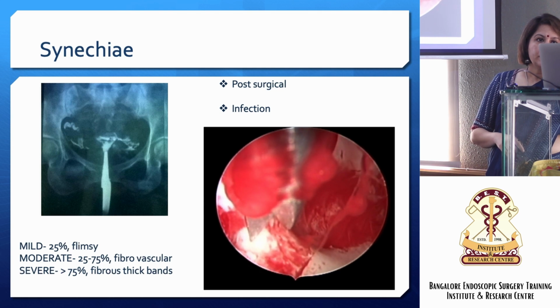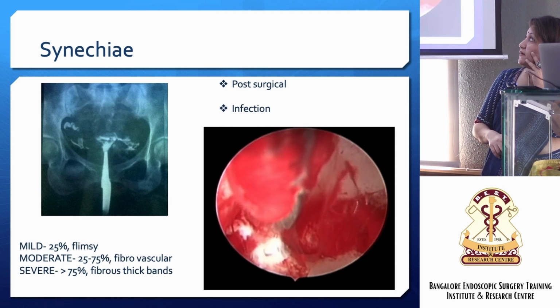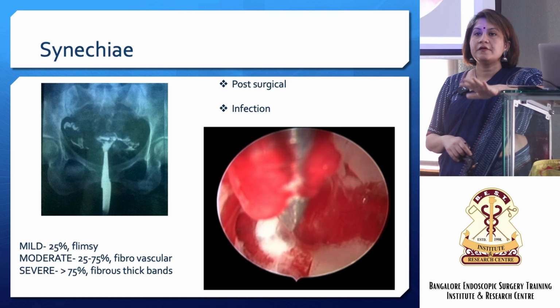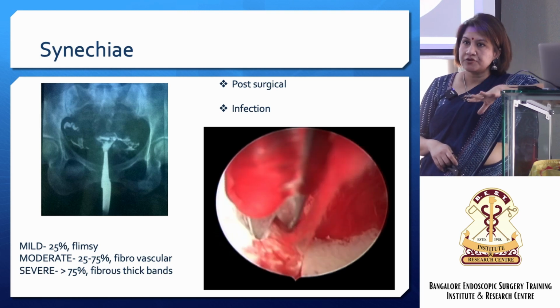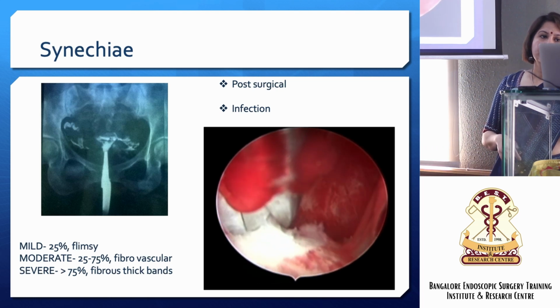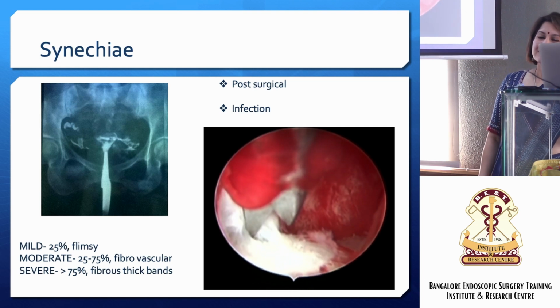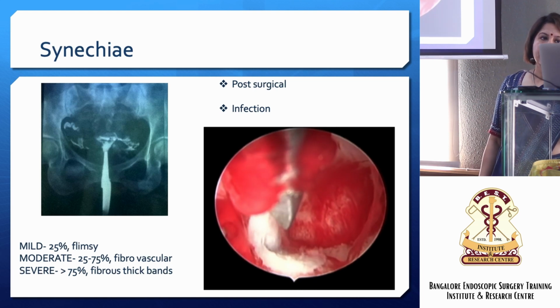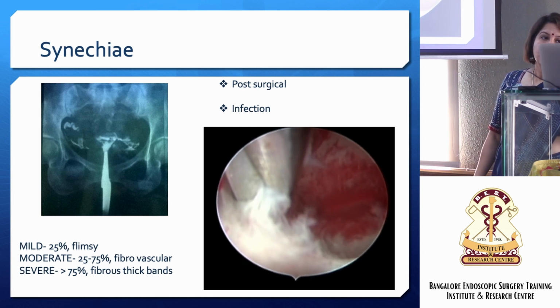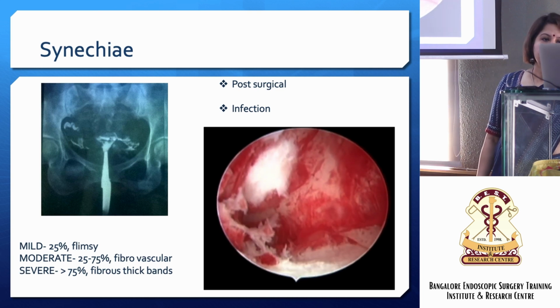The other surgery that is only done hysteroscopically, and is relatively satisfying, is the synechiolysis. And again here there is no role of electrical energy because the endometrium is already damaged. So as much as possible use scissors for division of the synechiae. With a simple synechia like this, it's very easy. You just have to take a scissor and cut it. Here I realize the rest of the endometrium is nice and vascular. That's why the field became bloody; initially it was looking like a nice synechia, but by the time you put in your scissor and cut, it became bloody. But that's a straightforward synechia.